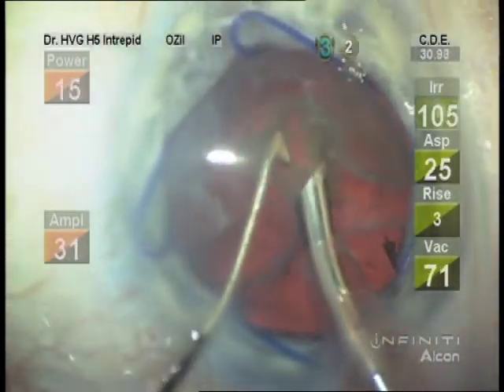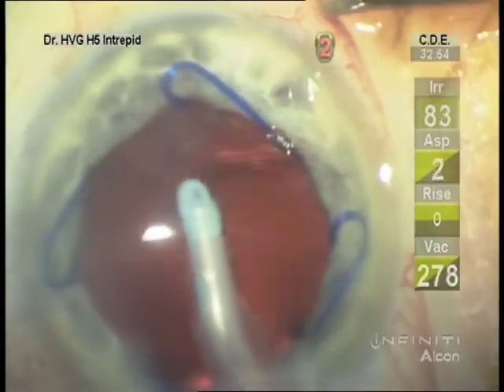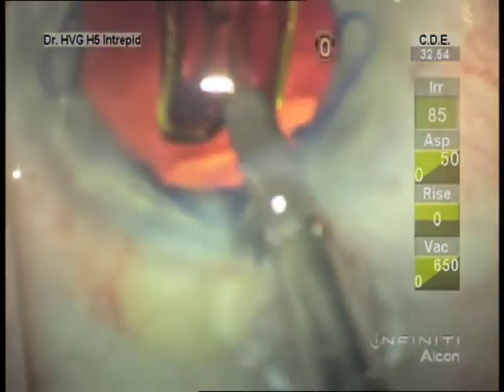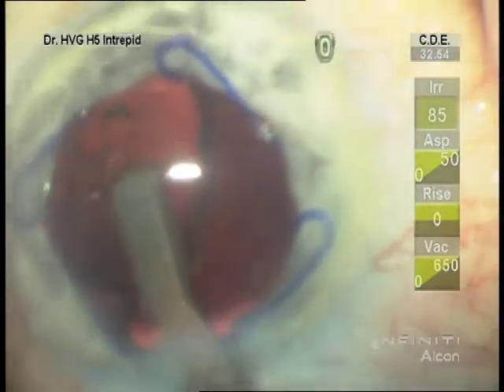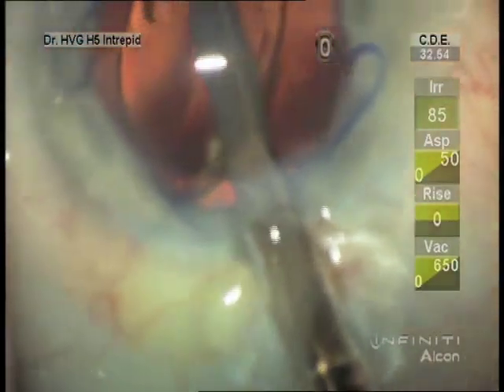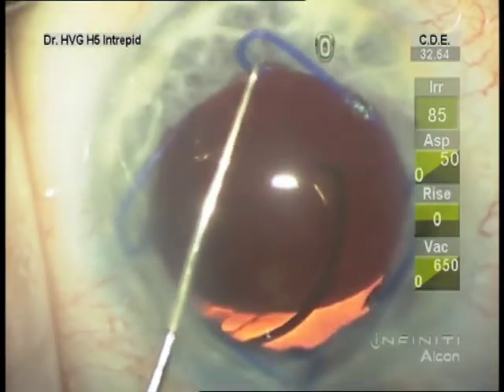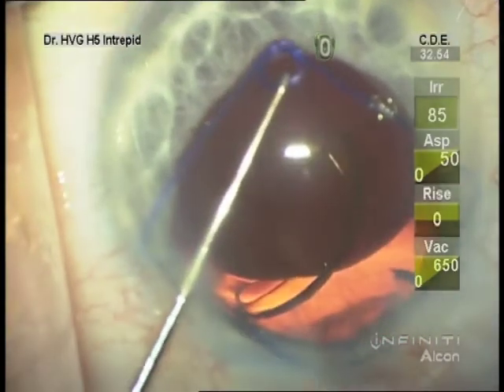That has been edited down — we're showing mainly the pupil expander here. You can see the sub-incisional cortex was removed first. You'll note I like to use the injector to position rather than using a cannula or a synechiae hook.